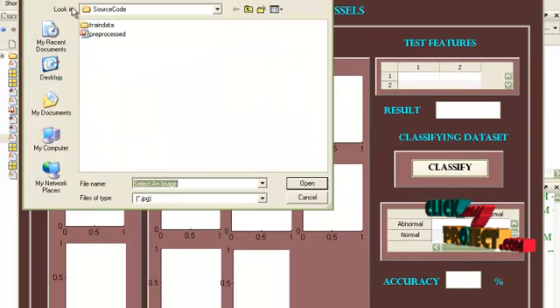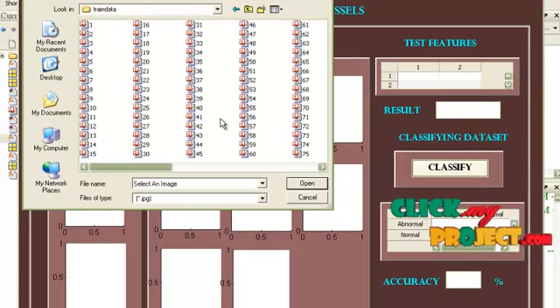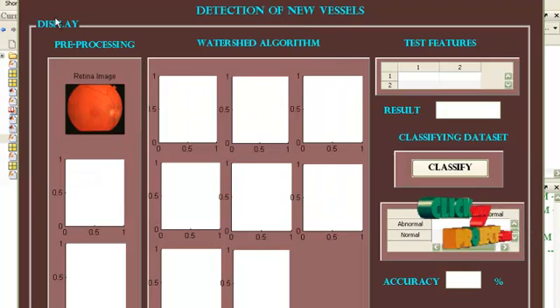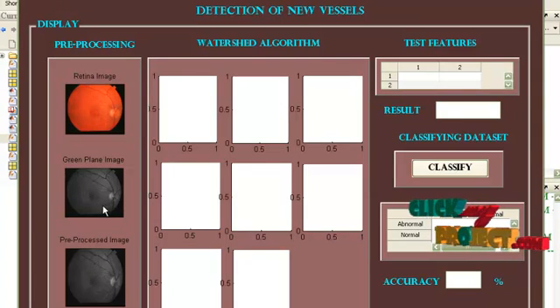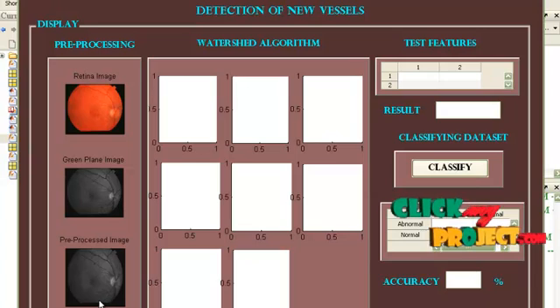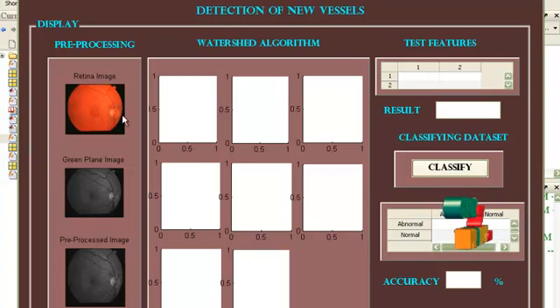Select any one of the images from this folder. I am selecting one of this image. I am pre-processing the image. This is a green plane extraction and this is the pre-processed image where the edges are preserved.